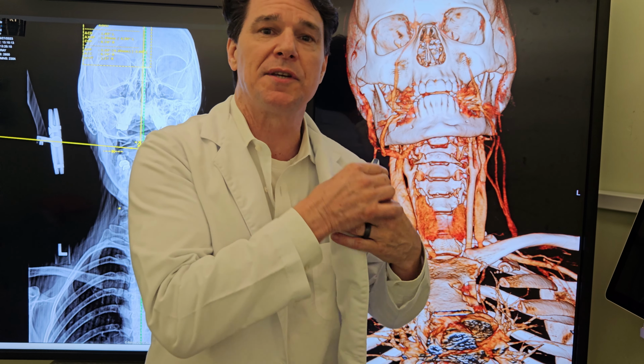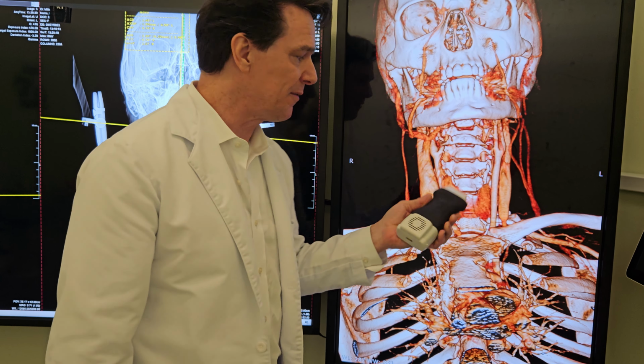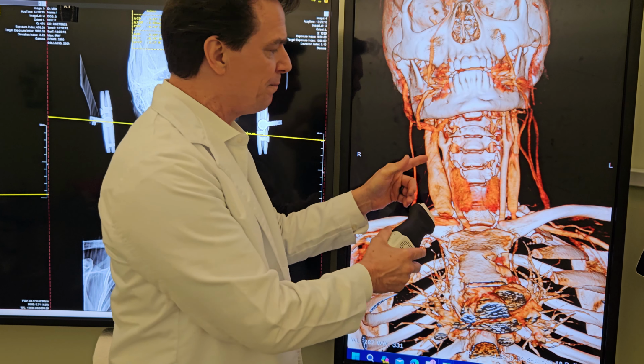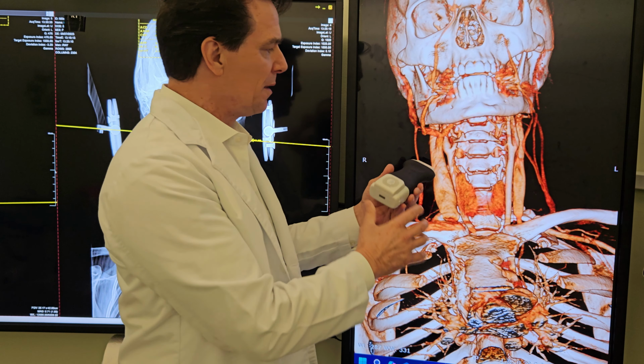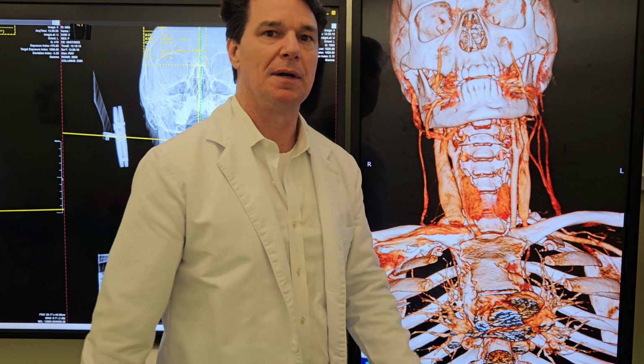Oh, and the other thing is, when I said ultrasound in the video, we're using pulse wave Doppler, we're using the Clarius L7, and we're basically checking the speed of the blood flow going through there, the blood volume. That's what we tried to do, but she reacted so quickly, but we did get some good measurements in there.